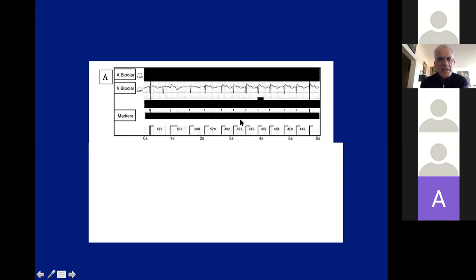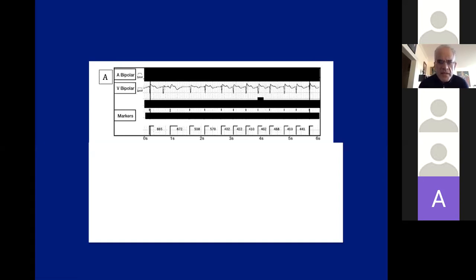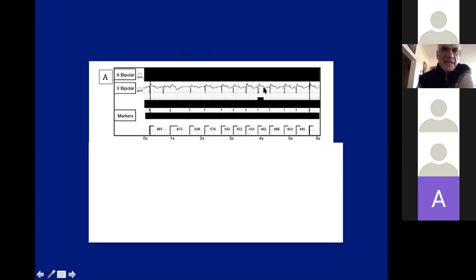Here is an example. This is a dual-chamber device with the atrial channel covered, so you just have the ventricular bipolar electrogram and markers. Does the morphology change? Morphology looks similar. Is the onset sudden? It is sudden. Is it very fast? No. Is the V-to-V stable? No, it's actually unstable — a variable V-to-V. Do we see atrial signal on the V channel? I don't think so.